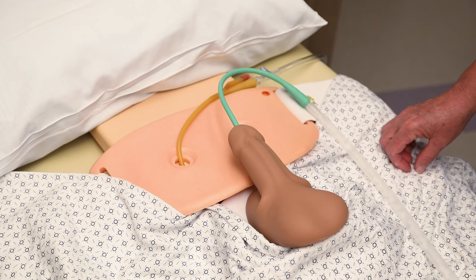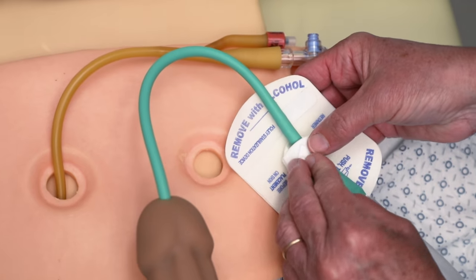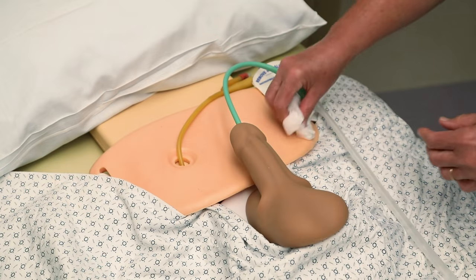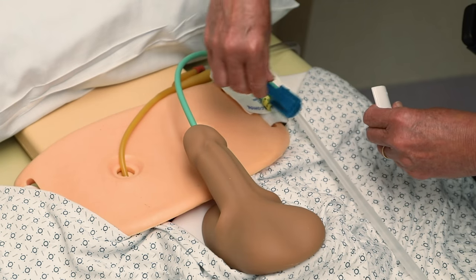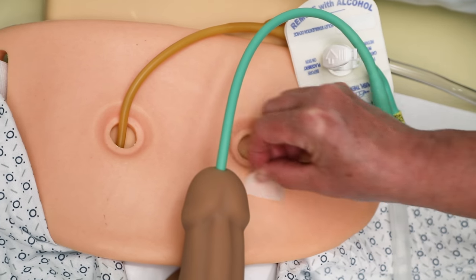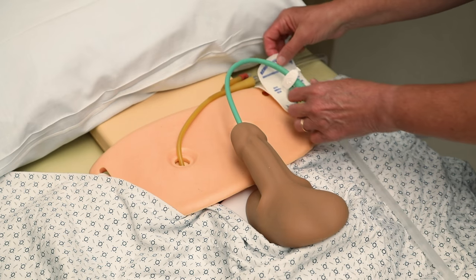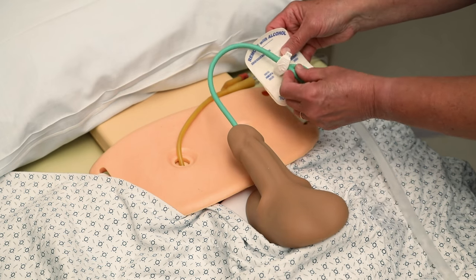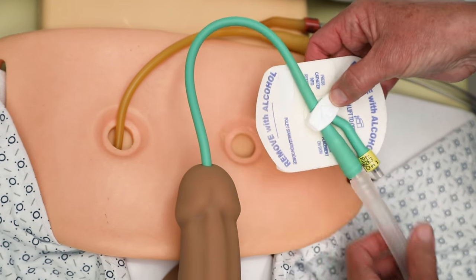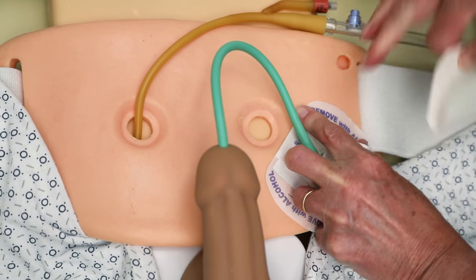A Foley stabilization device allows the catheter to be anchored at the y-connection on the catheter. The mechanism allows the catheter to swivel. If hair is present, wet the skin and shave in the direction the hair falls to prevent skin irritation. Apply the skin barrier film and allow it to dry. Place the catheter into the Foley stabilization device and find the best location to place the device, ensuring a loop is present between the end of the catheter and the device. Secure the stabilization device to your body.